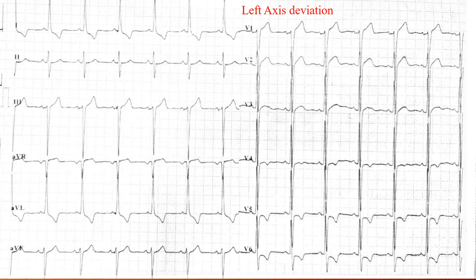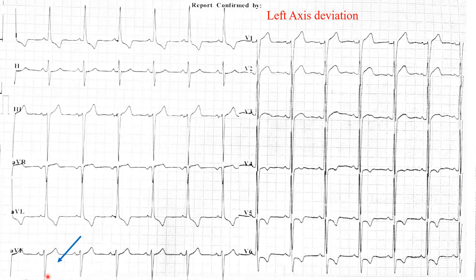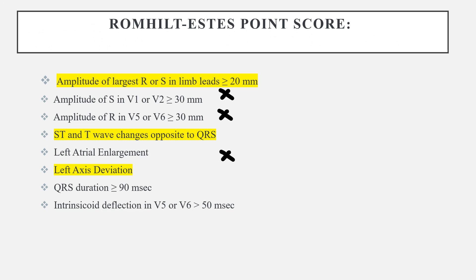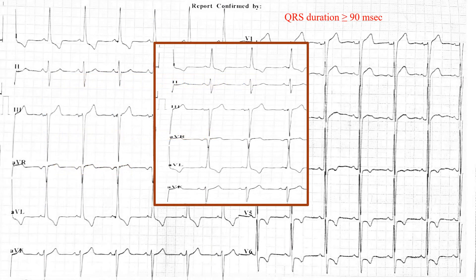For left axis deviation, we can see that there is a negative vector in lead AVF, which is typically present in left axis deviation. So this patient does have left axis deviation, and this criteria is met. For QRS duration, it should be 90 milliseconds or more. The QRS appears slightly broad — not the narrow appearance seen in a normal ECG — and this width measured 90 milliseconds, so this criteria was also fulfilled.